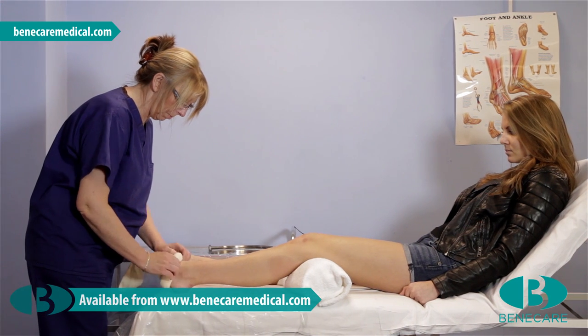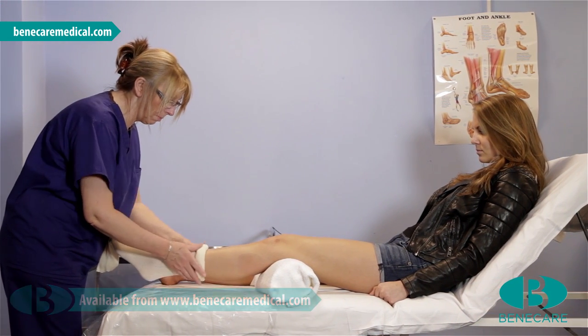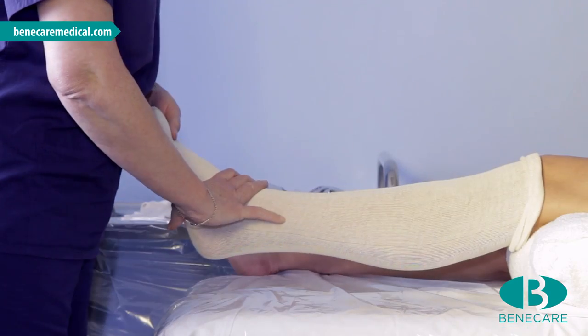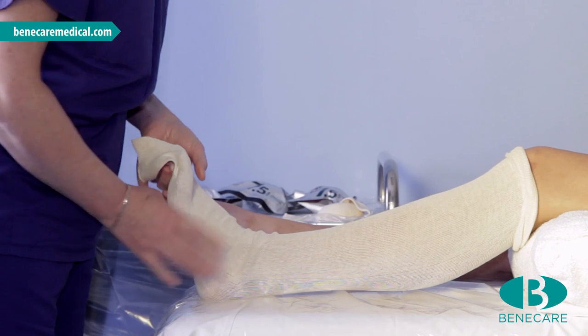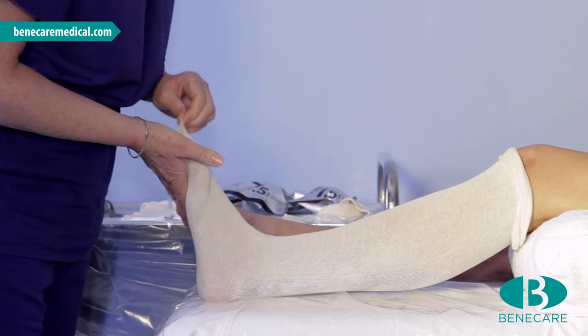Start by applying one layer of stockinette extending from the toes to the tibial tuberosity. The limb needs to be in the correct position, which is plantar grade, before you begin the application, and this must be maintained throughout the procedure.